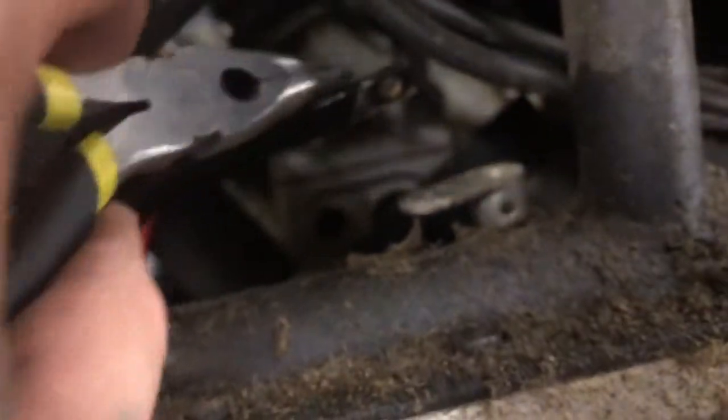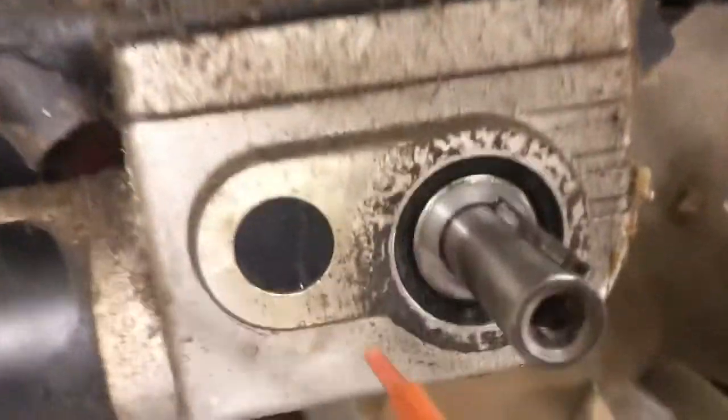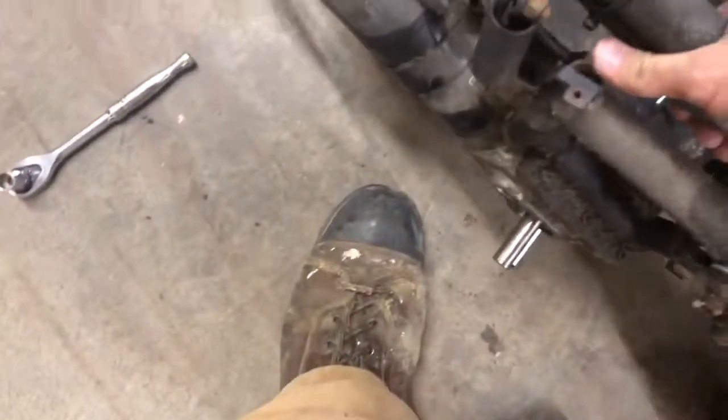So now that that's done, you have, okay, make sure the top of the screw doesn't fall out. So this will be loose, so make sure you take it out because mine just fell down in the frame. Okay, now that that's over with, go ahead and flip the chair back down if you flip it up. Very gently. Okay.